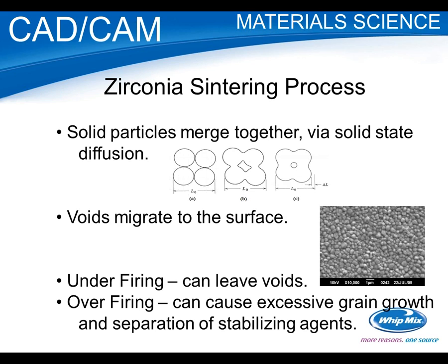And follow that. The reason this has become an issue is we've had a number of folks that, in porcelain, and I'm not a porcelain expert, but in porcelain, sometimes if you overfire it a little bit, it'll help your translucency. And that really isn't the case with zirconia. It's really not melting. You have a couple of grades. You've got one grade for copings. It's very opaque, and people don't try to overfire that. But the other grade is for translucency. They want to get the translucency of porcelain, and to be honest, it just doesn't happen with zirconia. Zirconia isn't that translucent. A lot of folks think, well, if I overfire, it'll get there. And actually, if you overfire, you'll get a glassy look, and some people may think that means it's more translucent. But if you've gotten that far, you've greatly destabilized your product. It's going to be very sensitive to low temperature degradation. You'll have cut the strength in half. So again, be wary of overfiring.